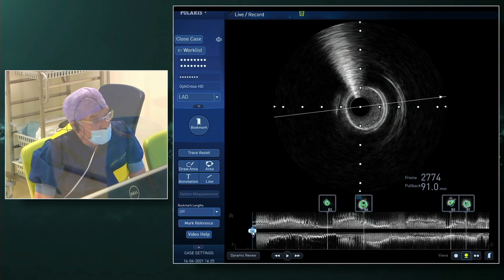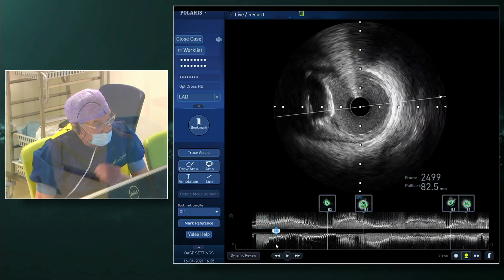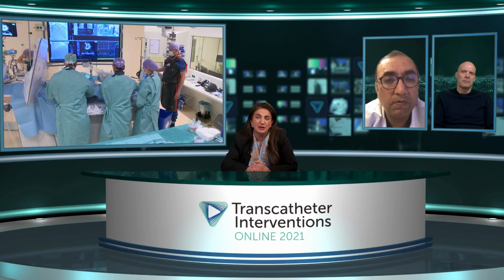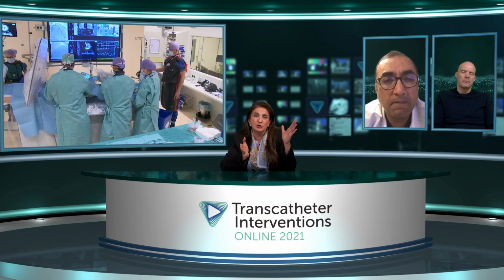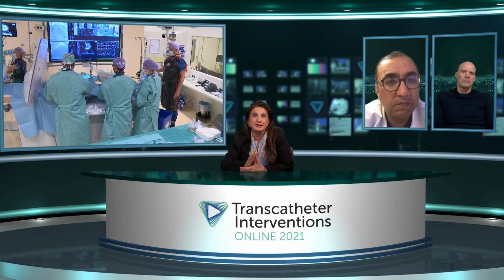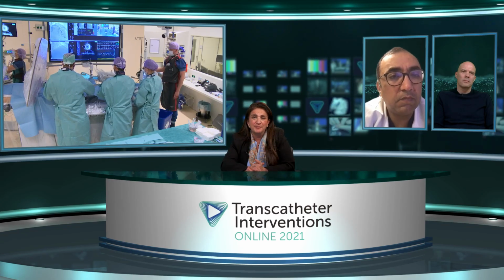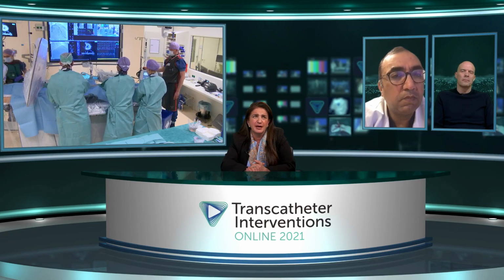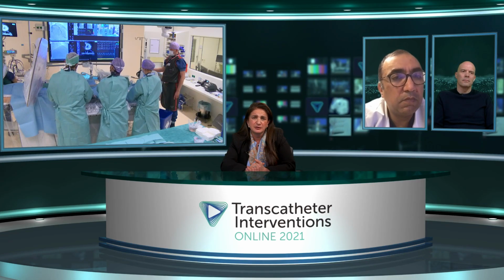So far, so good. Any questions? I have, this is great. Just looking at your QFR, it seemed to us, and please correct us, that maybe just focusing on that proximal large vessel is the way to go. But it sounds like you really want to treat the entire vessel. Can you just expand on that? Is that what you want to do, Joost?